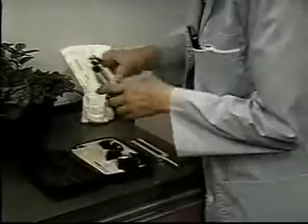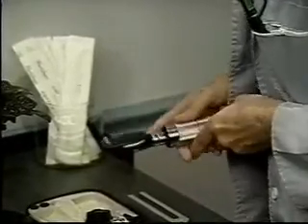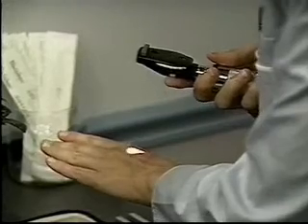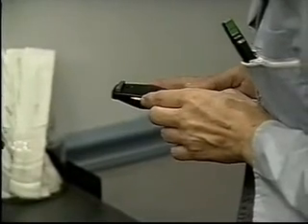When you're ready to examine the fundus, switch on the ophthalmoscope light and adjust it to the large round beam of white light. Also make sure the light is bright enough. Set the ophthalmoscope to 0 diopters. After darkening the room, ask the patient to look over your left shoulder at a specific spot on the wall.